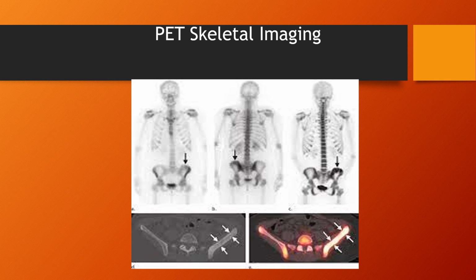You compare the right and left on the CT image, you'll notice that that lesion is a lot bigger and dense seen on CT, but it's not real specific for what it is. And then if you combine it with the sodium fluoride images, you can see that that's the area of increased uptake.